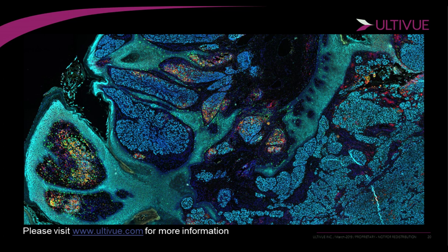They're very robust, so we don't run into a lot of photobleaching. But if you're using an older type scanner that is dumping full amounts of white light directly onto the slide while scanning, you do run the risk of starting to photobleach, which obviously would impact the stability and the longevity of those dyes for long-time storage.